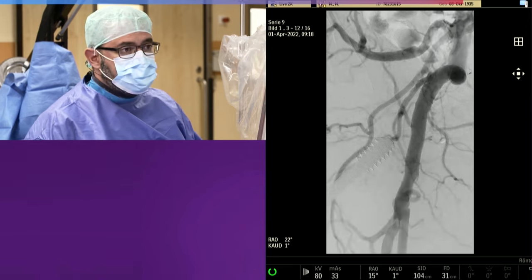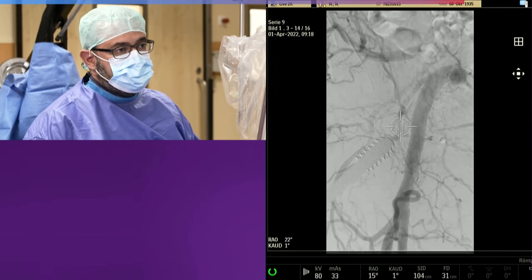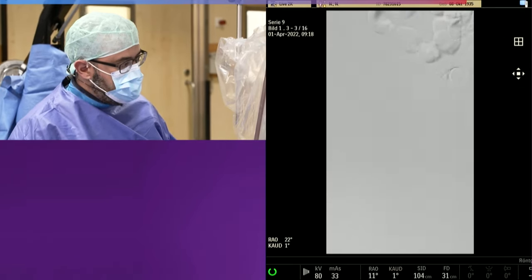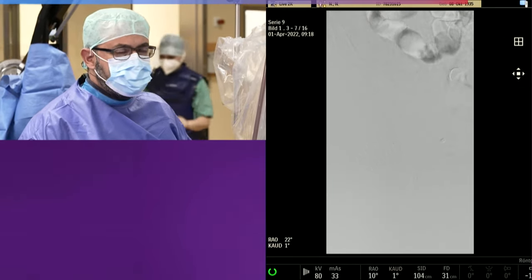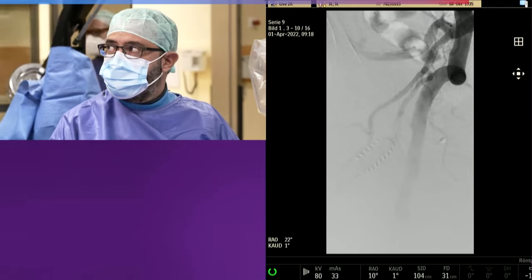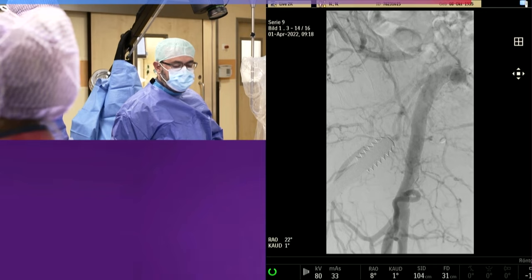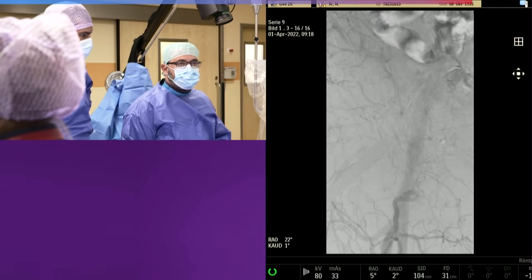Even with a previous intervention and a ProStar implantation. Yeah, 2012 it was a ProStar. But probably, I don't know, are these resorbable? The sutures? No, not resorbable. Or the ProStar, they're not resorbable. So if we open up now, we will find them.